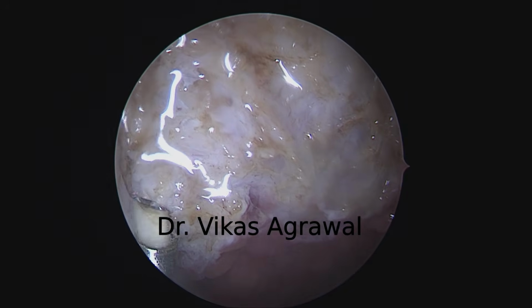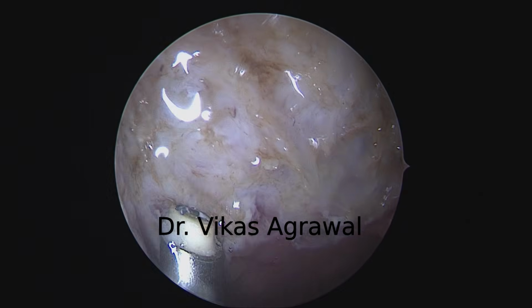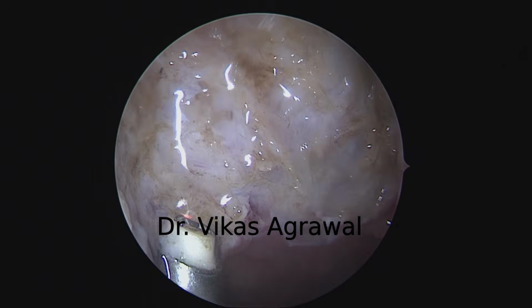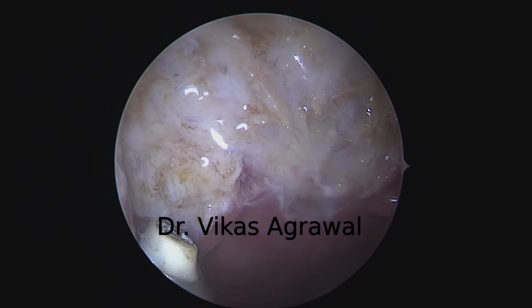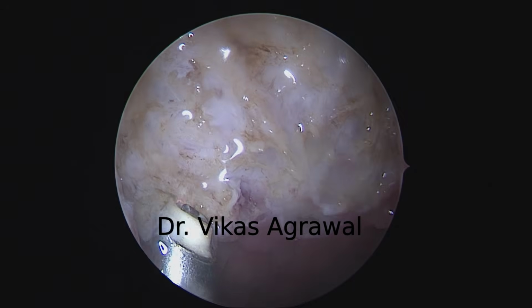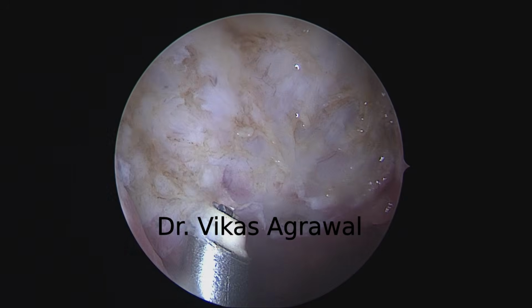Now, trying to remove the lateral bit very carefully because you can get some vessel from the lateral side. Always be very careful in the lateral part.